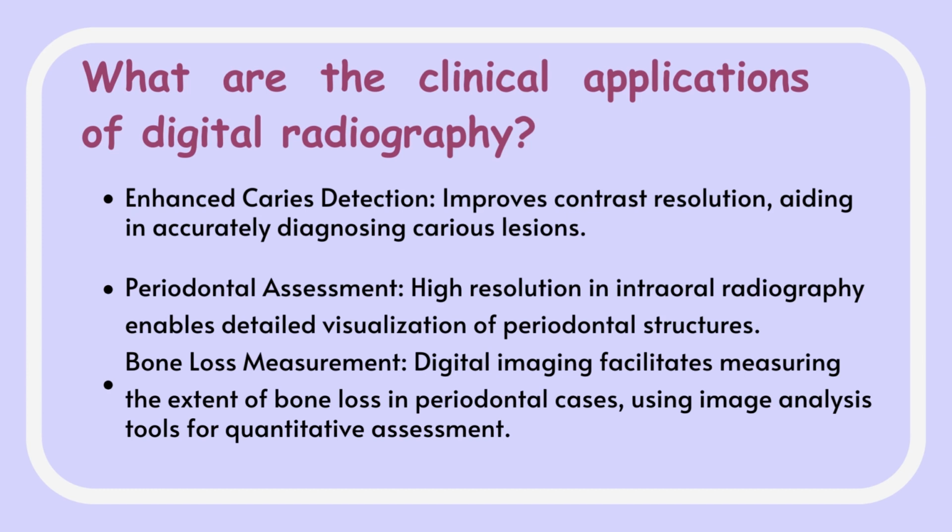Also, periodontal assessment. High resolution in intraoral radiography enables detailed visualization of periodontal structures. Bone loss measurement as well. Digital imaging facilitates measuring, helping us figure out the bone loss measurement in dentistry.